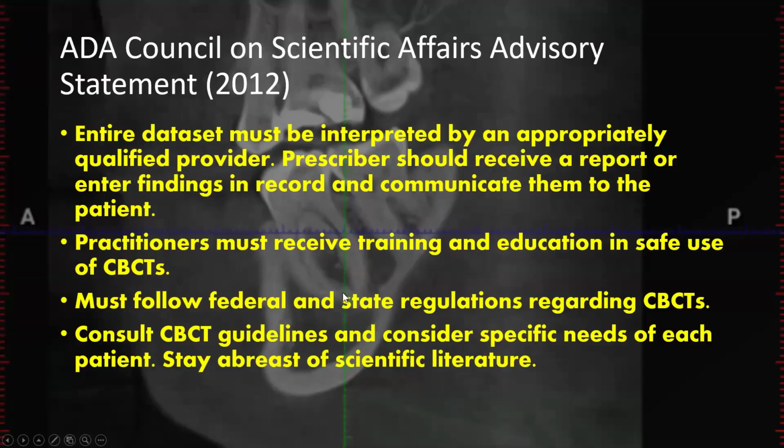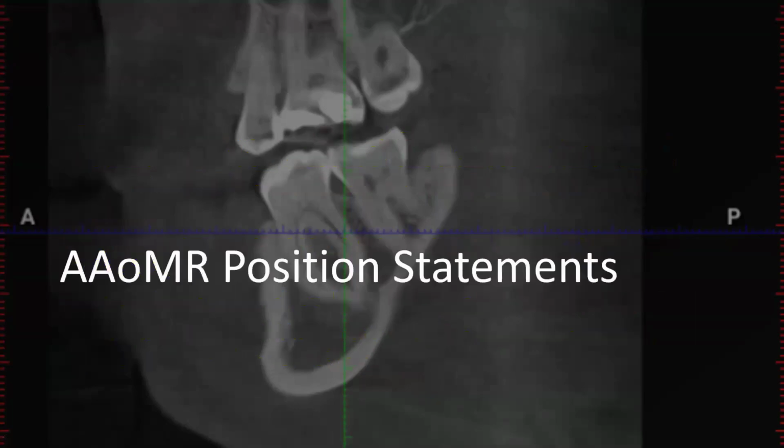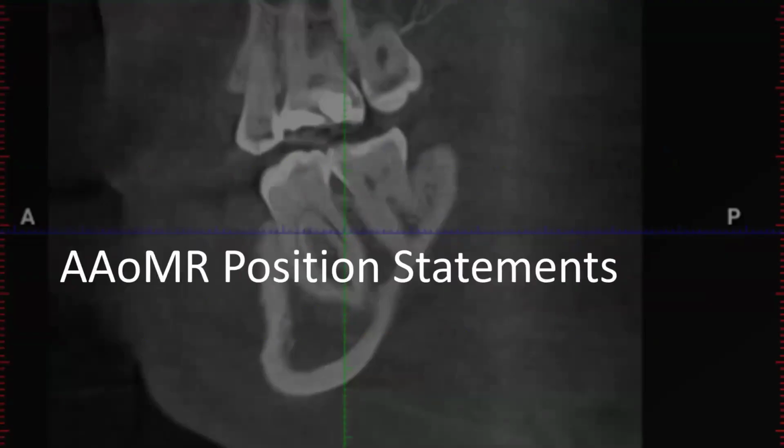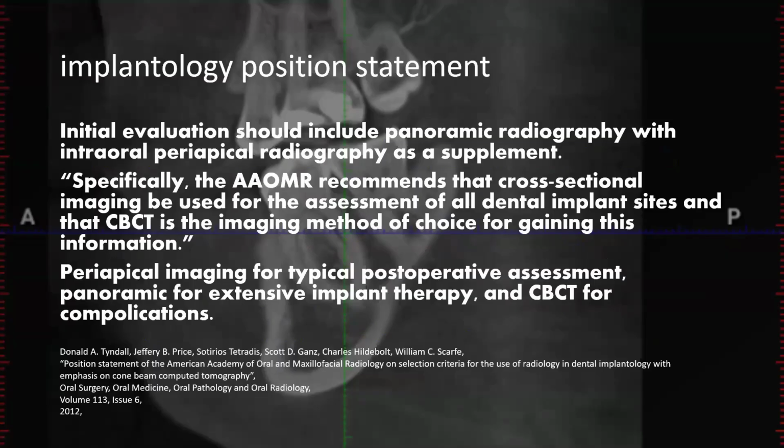So you should receive training and education, follow state and federal regulations, and consult CBCT guidelines. As we just showed, some of those guidelines are really confusing. They kind of conflict with each other. This is my organization, the American Academy of Oral and Maxillofacial Radiology. They've come out with some position statements, and basically they say for implants, yes, use it.